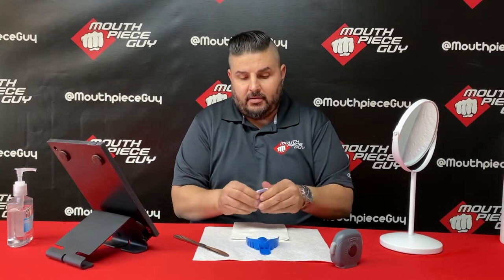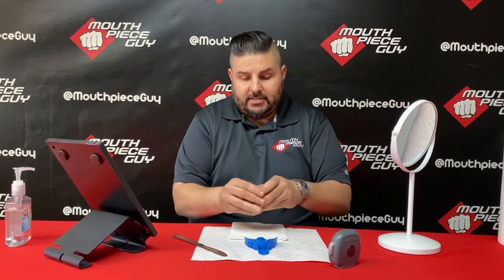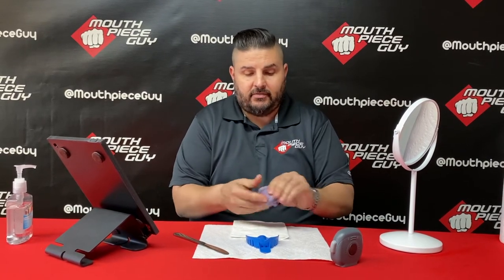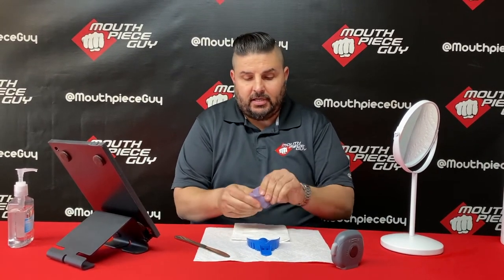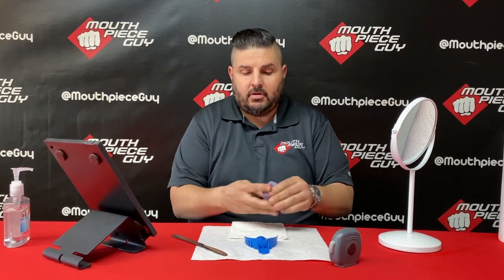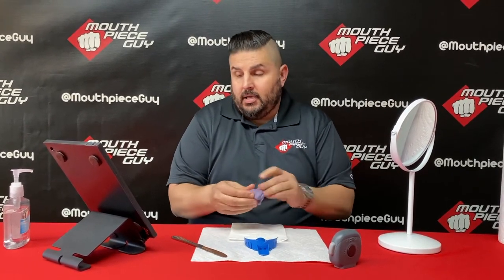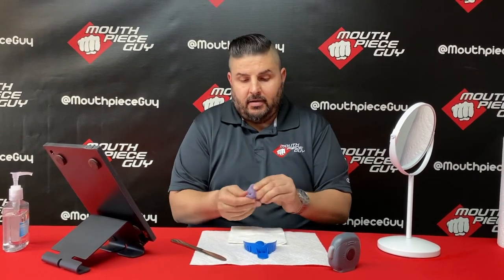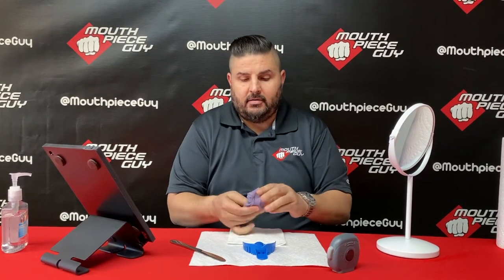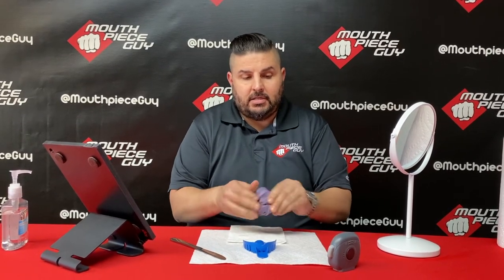So here we are mixing the putty. I'm moving as fast as possible — that's the key. You want to make sure you're mixing this stuff, squishing it, folding it together as fast as possible. If you take too long, you're screwed. I have the instructions up on the iPad and I'm using the timer guide, which tells me where I should be at each step.